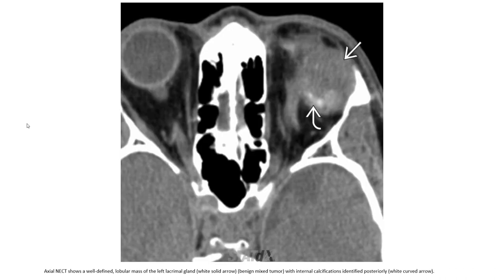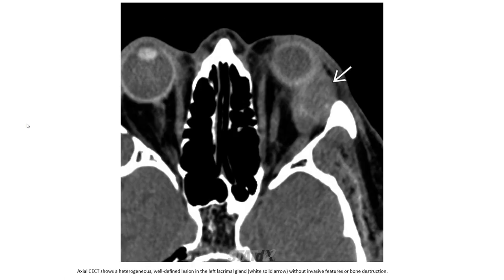On axial non-contrast CT, there is a well-defined globular mass of the left lacrimal fossa, indicated by the white arrow, with mixed attenuation and internal calcification identified posteriorly, indicated by the curved arrow. The axial contrast CT shows a heterogeneous, well-defined mass in the left lacrimal fossa, without invasive features or bone destruction.